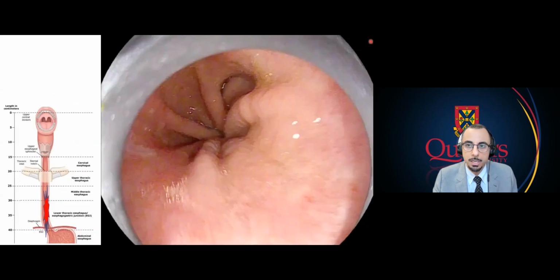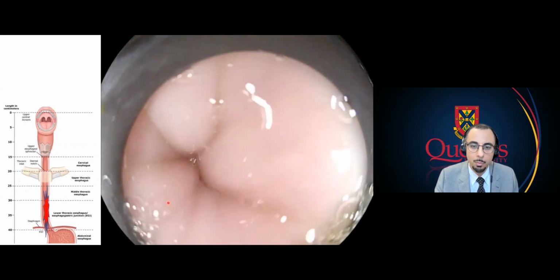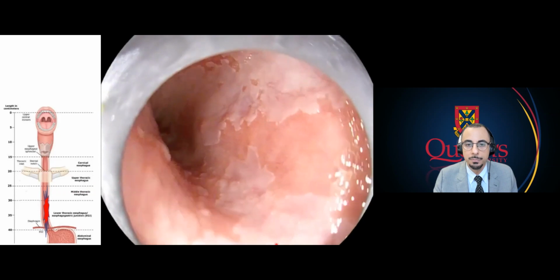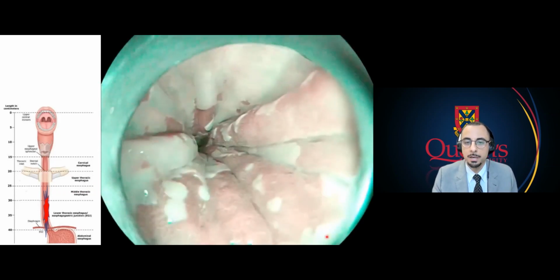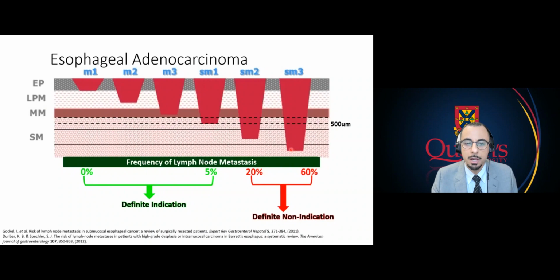So this is just a quick endoscopy showing you the distal end of the Barrett's. So this pink area is the Barrett's esophagus. Then you have this kind of a whitish mucosa, which is normal squamous. And then again, some Barrett's esophagus up here. And you can see it with the different modes of light. Again, it helps characterize things a bit better. But based on our examination, as I mentioned, we thought it was low grade, high grade, and some buried Barrett's.